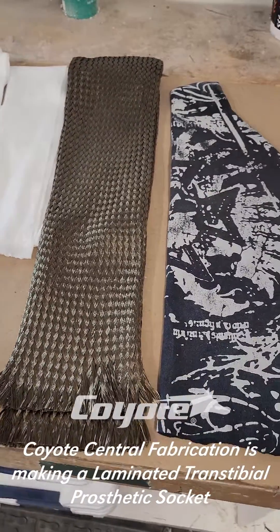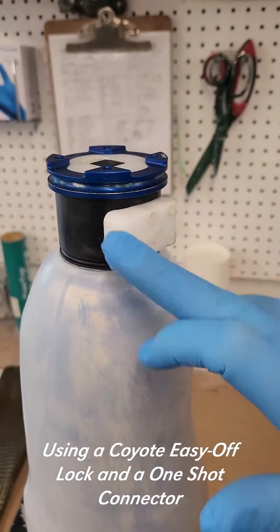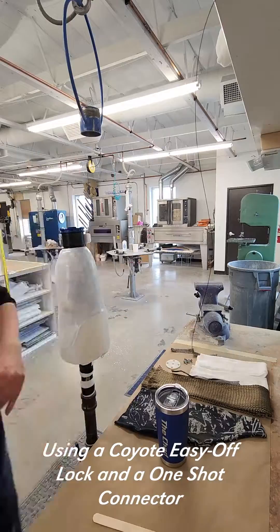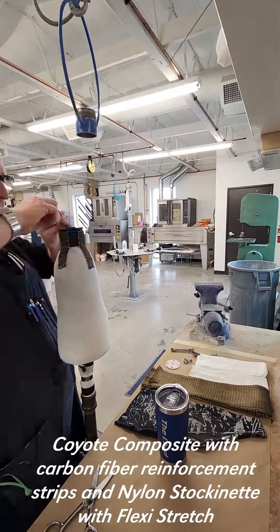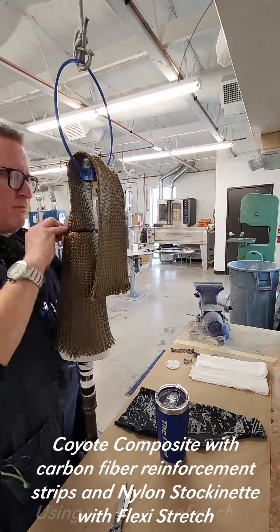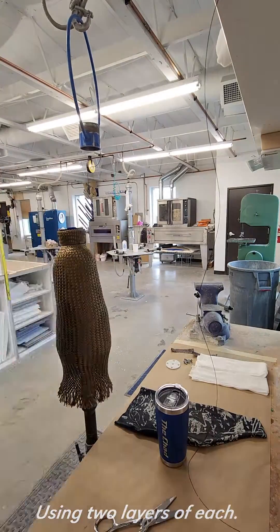Today here at Coyote Central Fabrication, we're going to be making a right trans-tibial prosthetic. We'll be using the CD117 Easy Off Lock coupled with the CD111 One-Shot Connector. We'll be using carbon fiber reinforcement strips distally followed with the Coyote Composite. We'll also be using nylon stockinette with flex-a-stretch as well. We'll be doing two layers of each, which makes that a 222 Coyote lamination.